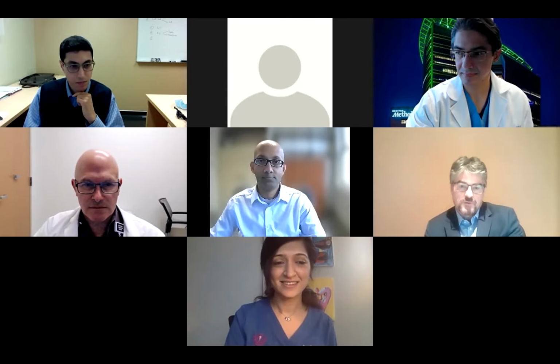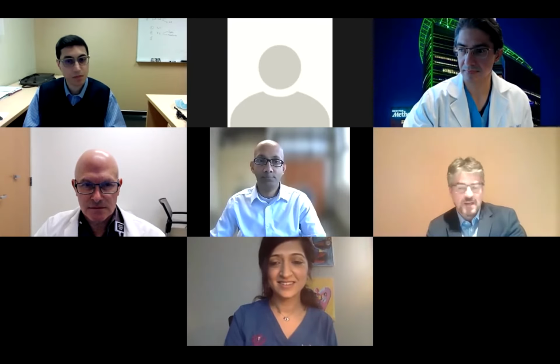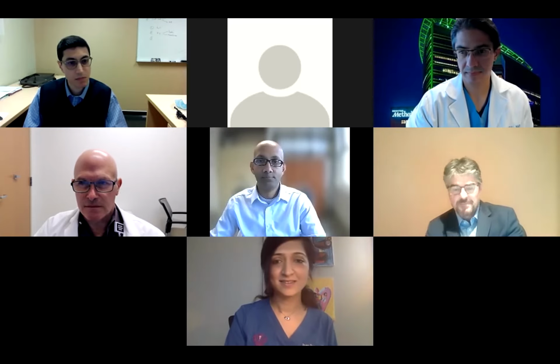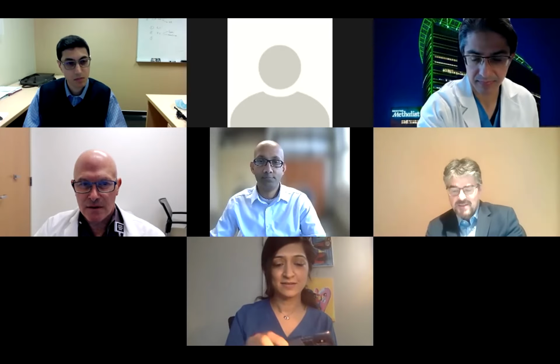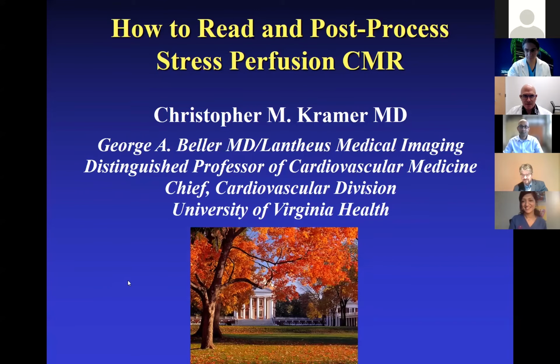We'll start with a short how to do perfusion and how to post-process perfusion, given by Chris Kramer, who is a cardiologist, head of division at the Department of Cardiology at the University of Virginia, and distinguished professor and past president of SCMR. I think everyone knows him. I'm happy to open the floor for you, Chris, for your introduction. Thanks, Eike.